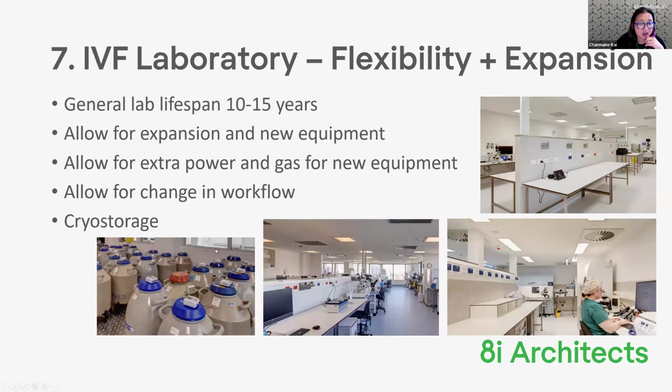But the big one coming up that's going to be a proper issue that needs to be looked at collectively is cryo storage. Tanks are growing. A lot of the big facilities that I've worked on are getting several new tanks a month. And it's something that we really need to be thinking about, how to store tanks better and safely, and not increase risk to patients in case there's a failure within the tanks.